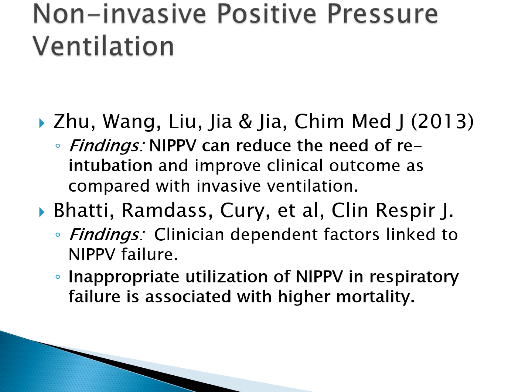So the settings need to be right, the interface needs to be right, and the patient needs to leave it on. The patient typically should not have restraints on when they're getting non-invasive positive pressure ventilation. Something to be aware of. The main thing is, if they vomit, they need to be able to pull the mask off. So just a sidebar thing to consider there.